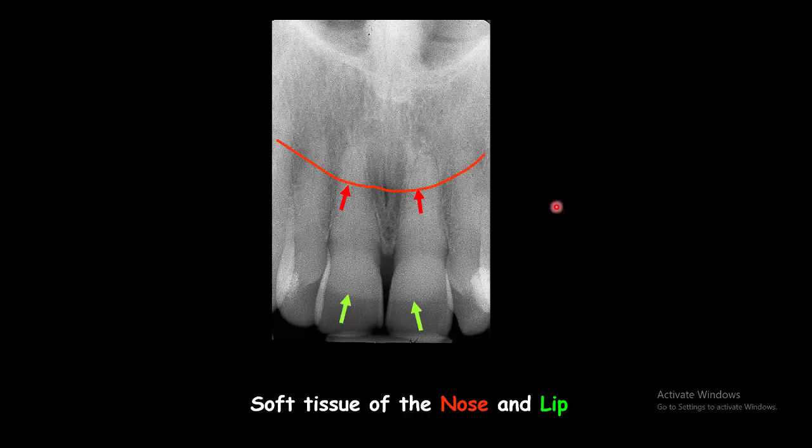The soft tissue of the nose is mostly seen at the apex of the central incisors. The soft tissue of the upper lip can also be seen in the projection of the maxillary central incisors. It is not seen near the crown of the maxillary central incisors.